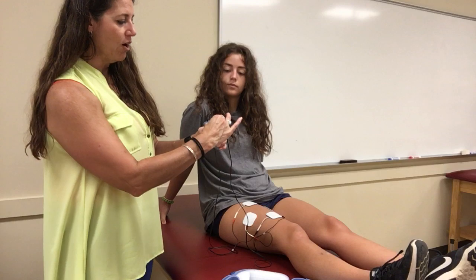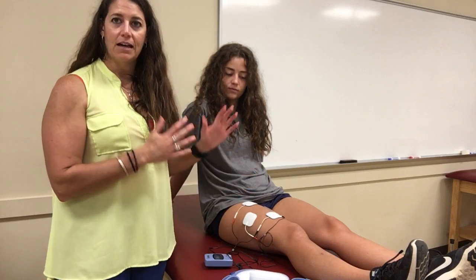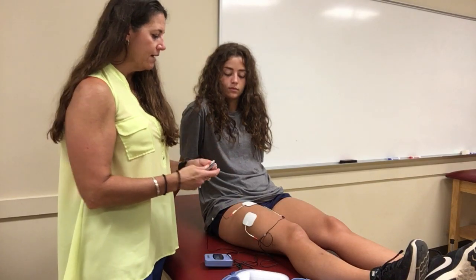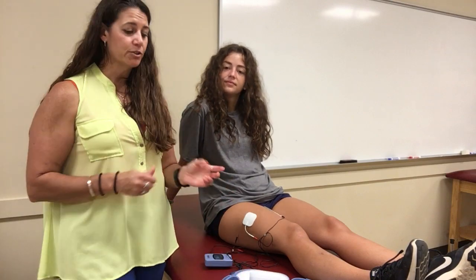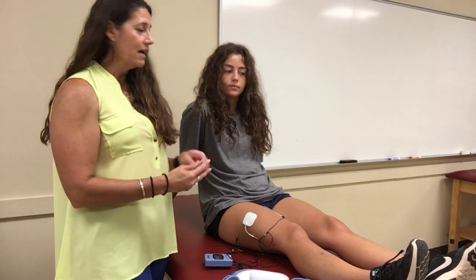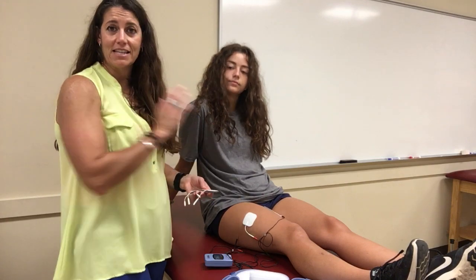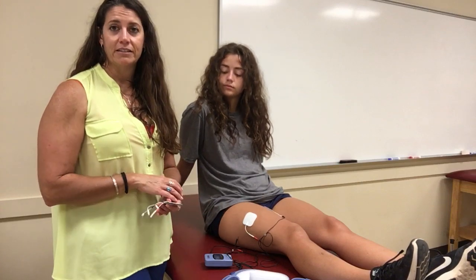When you're done, make sure you turn it to off — not increasing intensity — then take everything apart. You want to inspect the skin to make sure there's no irritation underneath the electrodes. These pads are reusable, so you can clean them off with alcohol pads. A good practice in the clinic is to write the patient's initials on their pads — for example, these become Meredith's pads. That way you don't have to worry about skin diseases or cross-contamination being transferred between people. Once they're done with treatment, throw the pads away. That's the TENS unit.